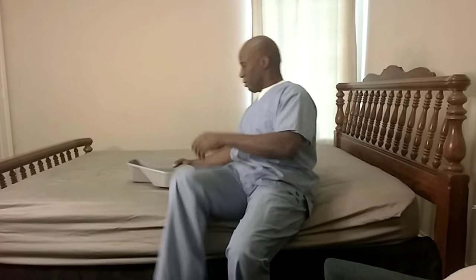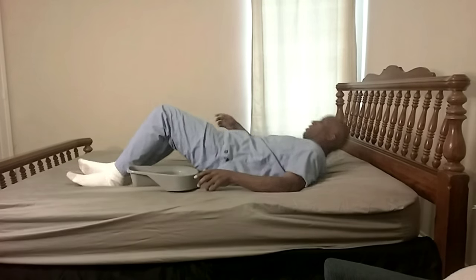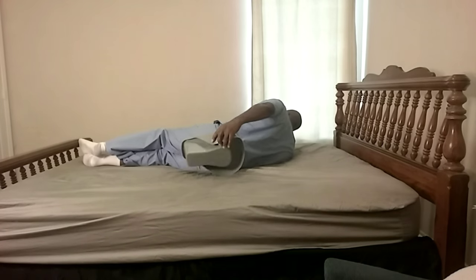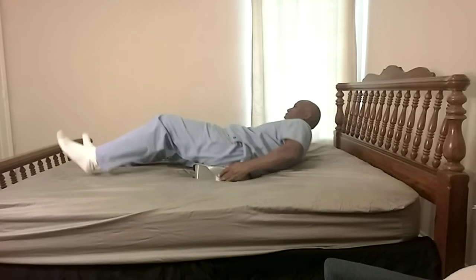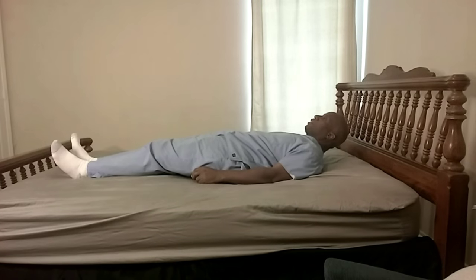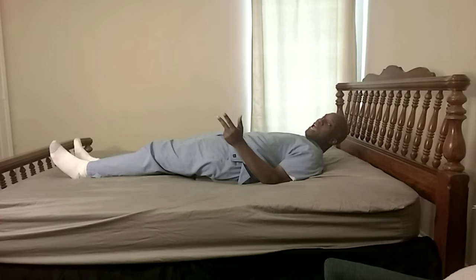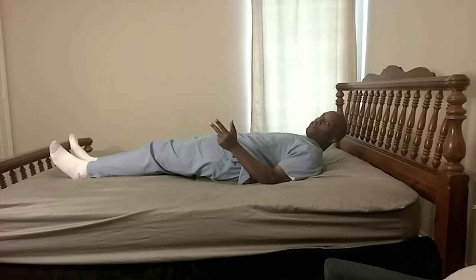This is the way for 500 years we've asked bedbound patients to go to the bathroom. Here's how it works: patients laying flat in the bed, either at home or in the hospital. We ask them to log roll over, stuff is placed under them, and they're laid back flat and attempt to go to the bathroom like this. This causes major problems: skin damage, spills, pain, and many patients simply refuse to try to go to the bathroom on the bedpan.